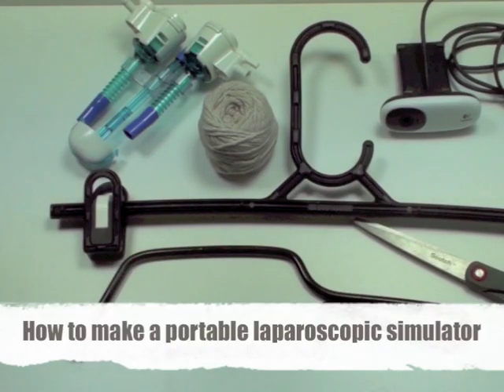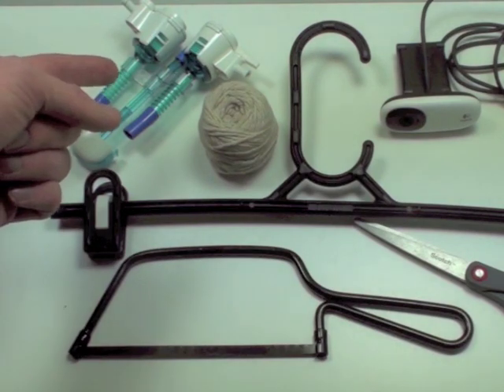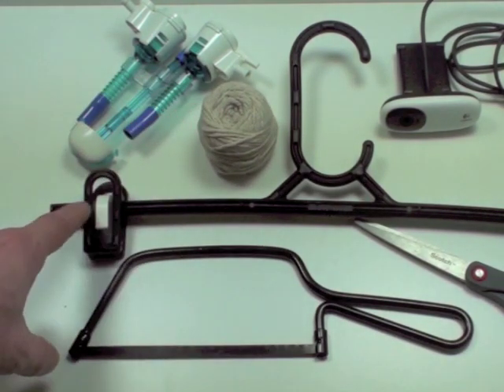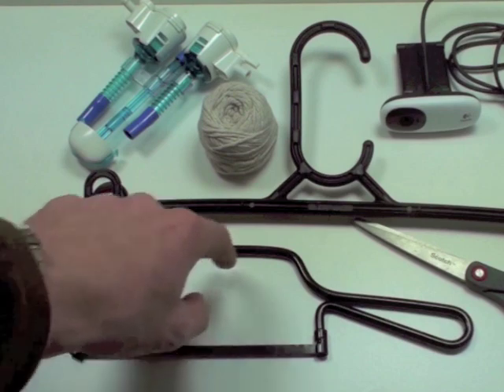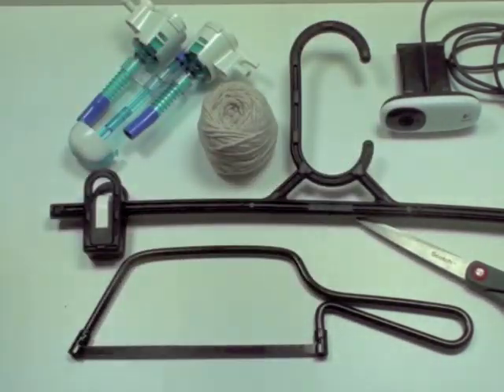This is essentially a video to show you how to make a portable laparoscopic simulator. These are the main items you're going to need to make this instrument. Some borrowed trocars, some string, a skirt hanger, ideally with adjustable clippers, a hacksaw, a pair of scissors, and a standard webcam. An HD one is better.